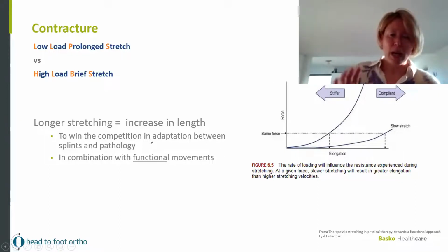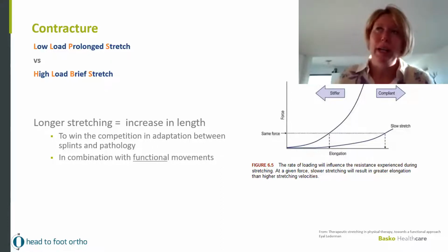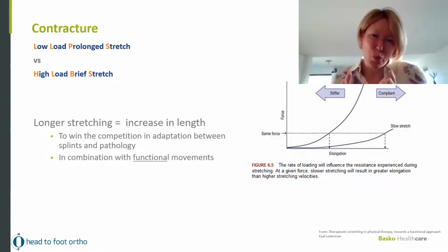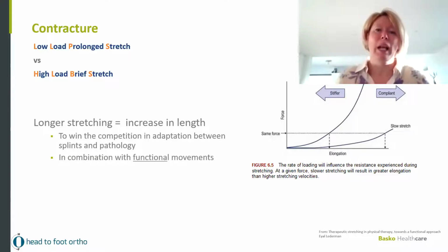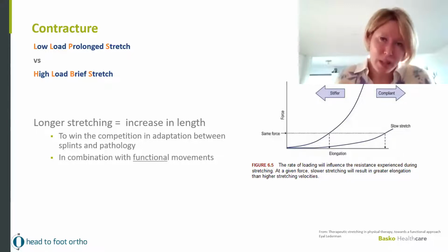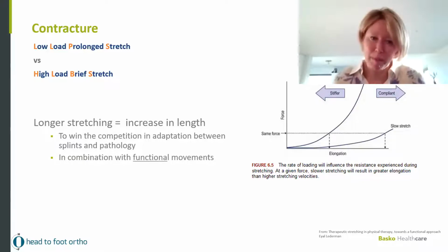So to win a competition, it's really like a little warrior, the pathology that wants to retract, and you have us wanting to win an elongation. Well, it's very important that we apply the orthosis in this case for a very long time. The longer you wear it, the better the outcome will be.